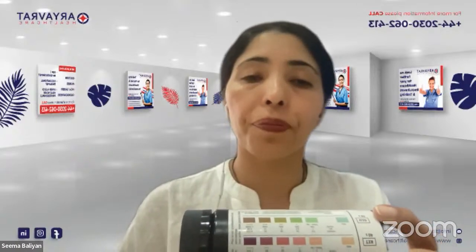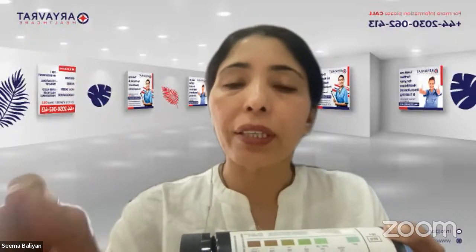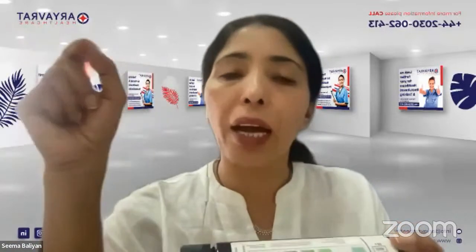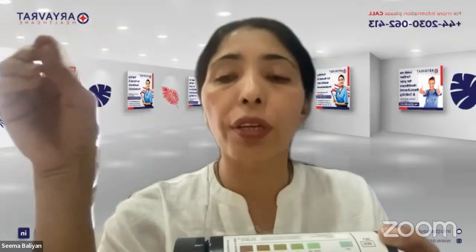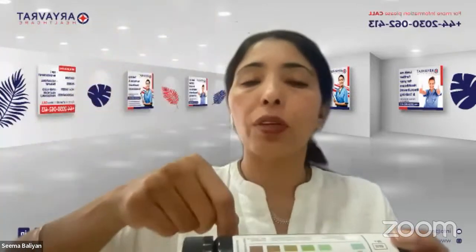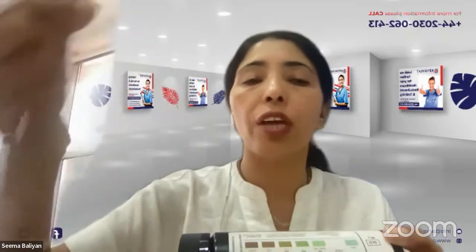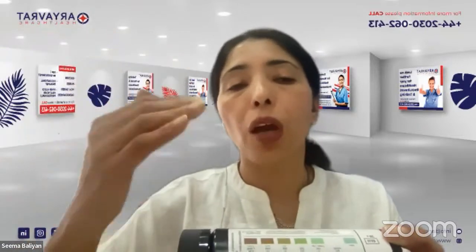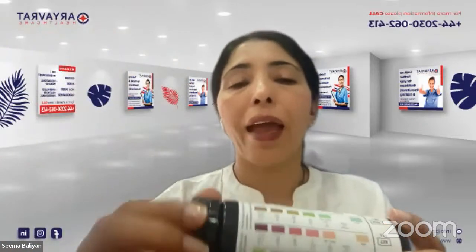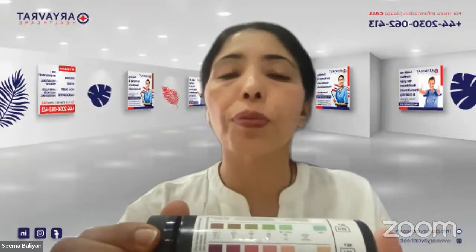and whether it suggests that there is a urine infection or not. Now, in order for you to read all these things, there is an optimal time at which you should read. That depends upon, once you have dipped the strips into the urine and taken them out, you check what time you dipped it in, and after that, you count the seconds.